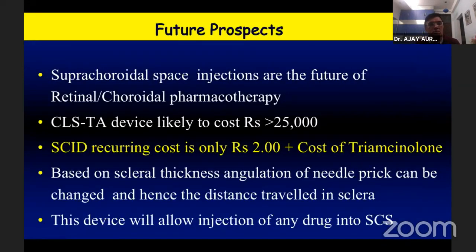So what are the future prospects? Suprachoroidal space injections are the future for retinal and choroidal pharmacotherapy. With the Clearside group, the cost is more than 25,000. With this particular device, the cost is only the cost of the needle and the cost of triamcinolone.